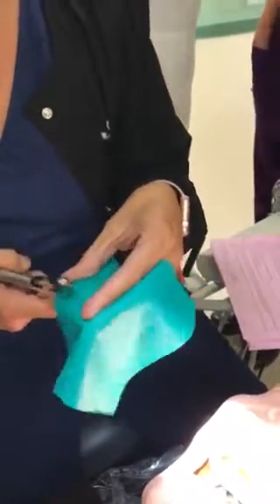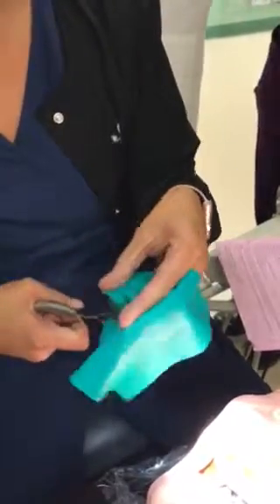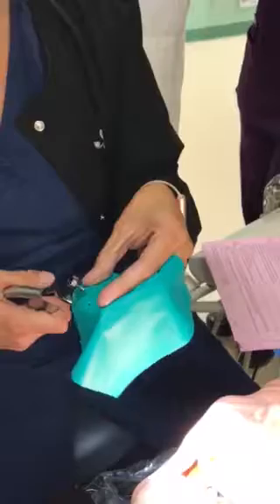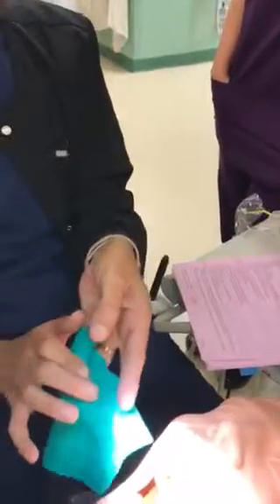And then since I'm in the maxillary, I'm going to switch it to 2 for my incisors. And on the left side, I can do my lateral and my central. And then on the right, I'm only going to do my central. Okay. So now I have my holes punched. I would lubricate my sheet if I feel that I need to. And then I am going to go ahead and place my holes over my central incisors.